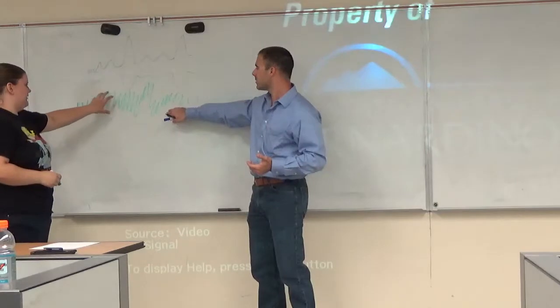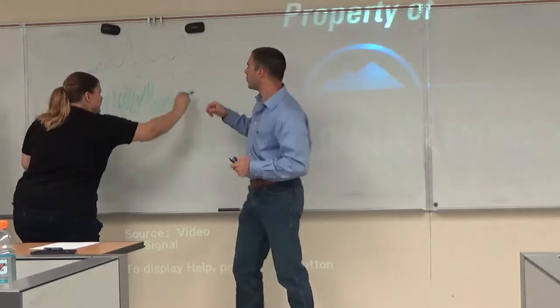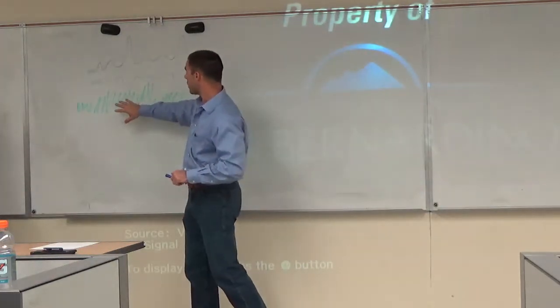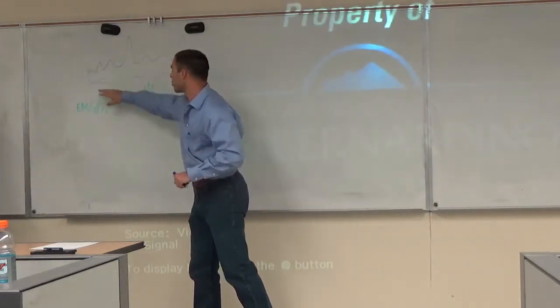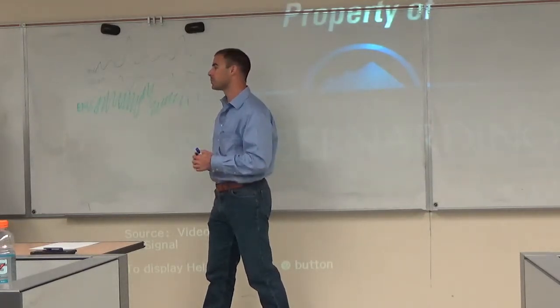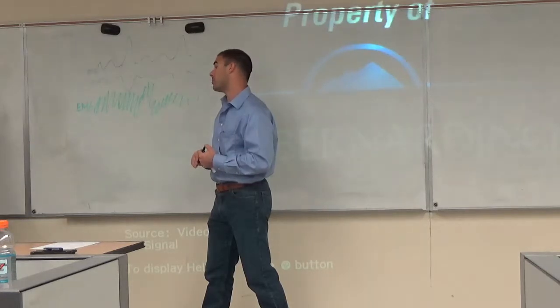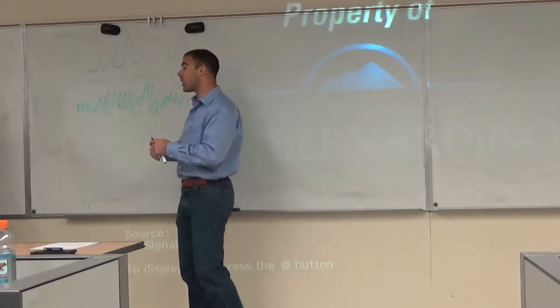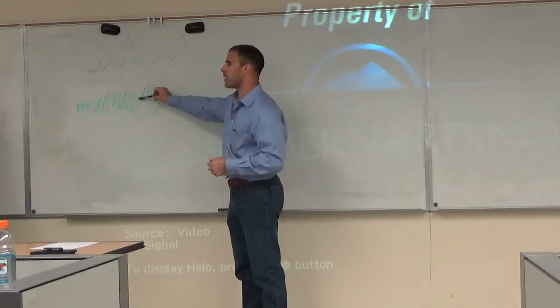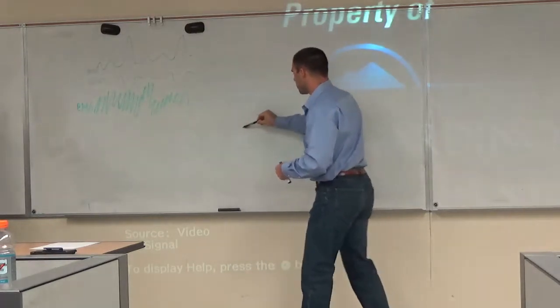Because it always looks very squiggly, this kind of maybe when you get some muscle tension. Well, okay. Right? But this would be the muscle tension. This would all be the high frequency muscle tension noise. So it'd be like low frequency if it was less tension. No, it wouldn't be the frequency, but amplitude maybe. Okay. Really high. So what's the difference between frequency and amplitude in this graph?